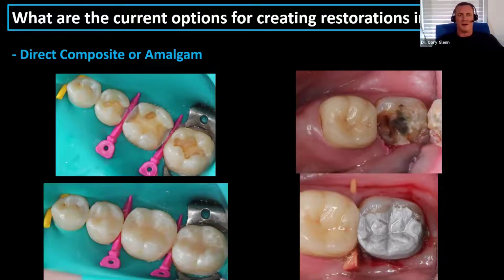So I'm somewhat recycling a presentation I did fairly recently for the Yankee Dental Congress on some of these new permanent crown and bridge resins that are available for printing. And I'm doing that because that's a really practical way, if you're trying to get into doing all of this in-house design and making your own restorations. I've been extremely impressed with those resins, in particular the Bego Varseo crown. That's the one that's FDA approved in the States.